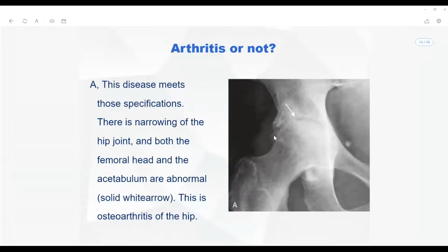And you can also see here that the reduction of the joint space will try to increase the density in these areas. And also, you can see that there are osteosclerotic changes along the articular surfaces. Which means to say, the inflammation fluid that has been released here is causing the increased density of this joint and along the articular surfaces, and the inflammation is caused along the articular cartilages and the articular cortex.